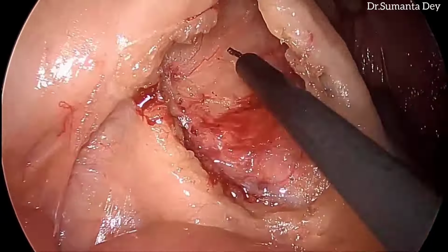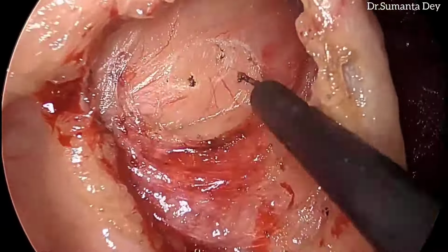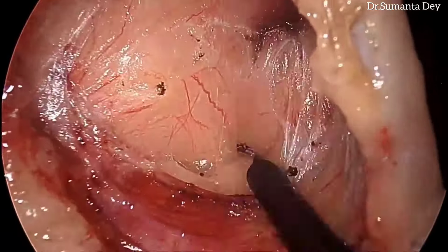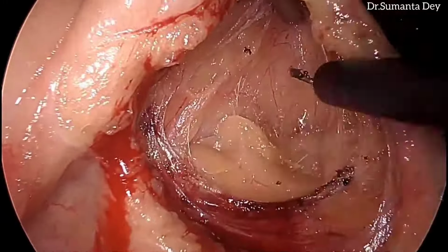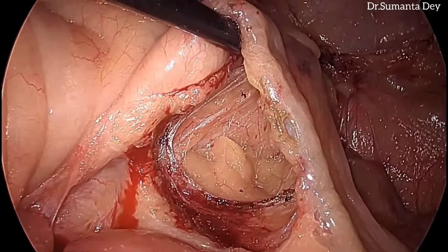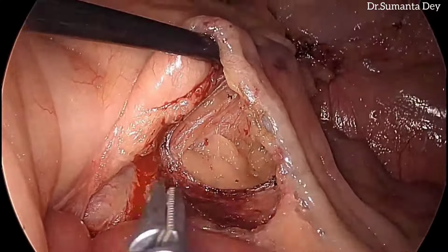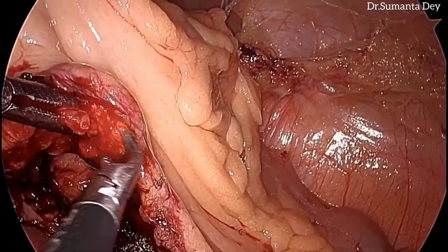Now I can see, gradually following the Toldt's plane, I am pushing the Gerota's fat down and lifting off the mesocolon gradually. This is the left mesocolon. So gradually the left mesocolon is lifted off.